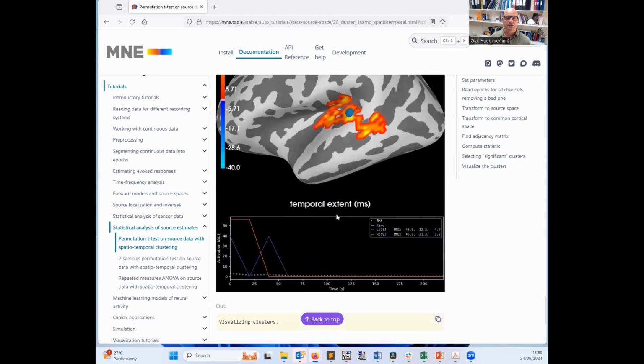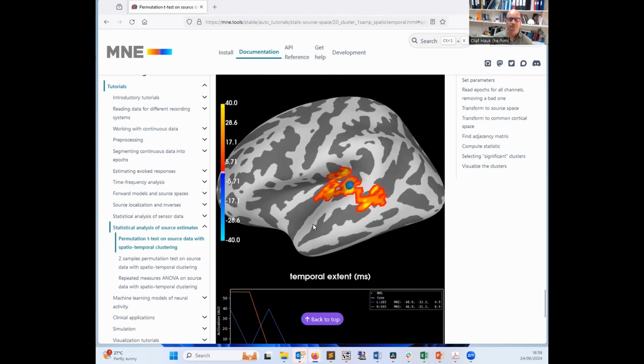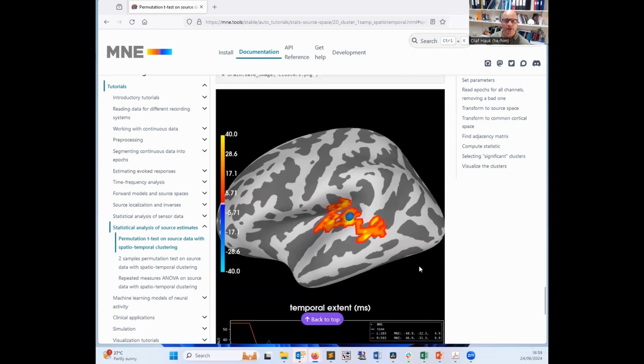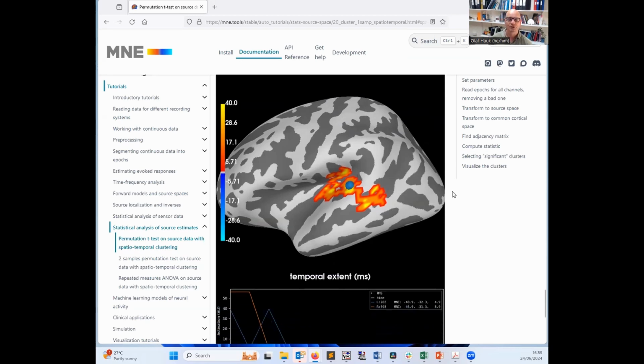Okay, and the other clusters, yes, MNE-Python gives you this first summary cluster as the first sample in this source estimate object, and it also gives you the other clusters as different samples in the source estimate object, so you can potentially also inspect the other clusters or the individual clusters. So this was really just a quick overview of how this can be done with EEG and MEG data. Of course, there are lots of details that could all be discussed in much more detail. And this is something that papers and maybe other presentations are for.